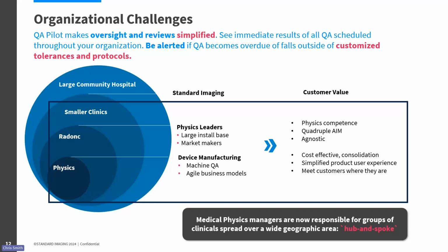So there's a few things that we want to make sure that we address by doing that, and that we customize those protocols and tolerances as you need them when you need them. And we always advise that we start a bit small on QA pilot, like maybe a couple daily devices and one clinic, and then build those protocols and then start to train and get the rest of your staff up on how to manage those things.